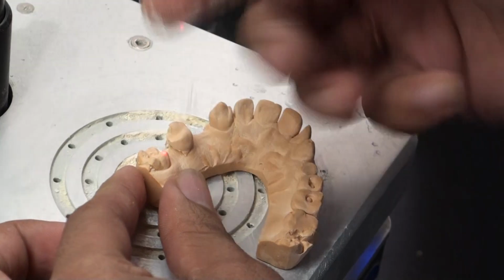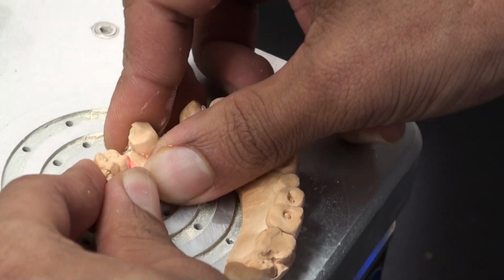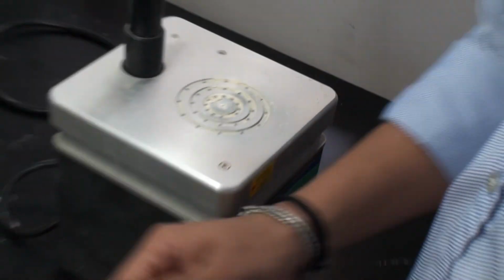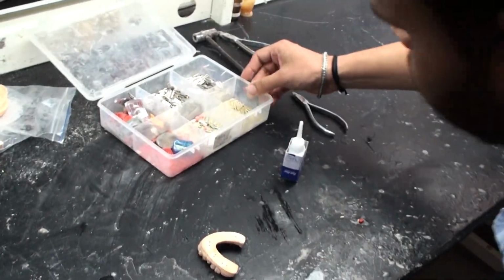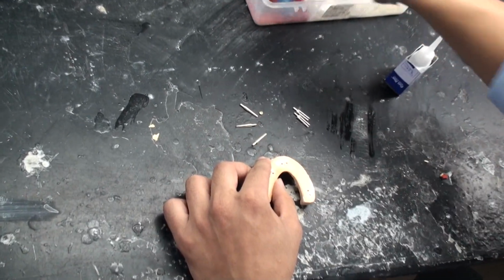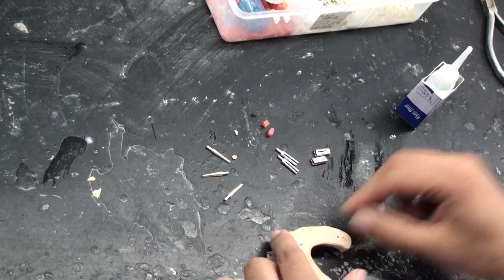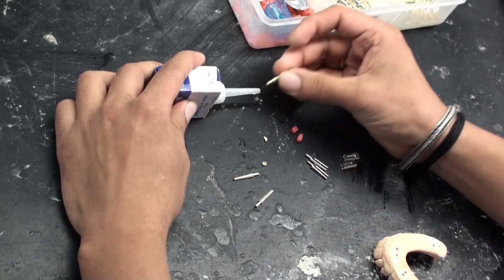Now that's where your pins are going to sit. That's the light, and he presses it, that's the hole right on the underside by pressing it, and those are all the holes done. Now the holes are all completed so that you can put the die pins in it, and it's got a selection of various types of pins. Some are single, some are double, and those little red bits are covers essentially that fit on them so that you don't get any plaster into them.